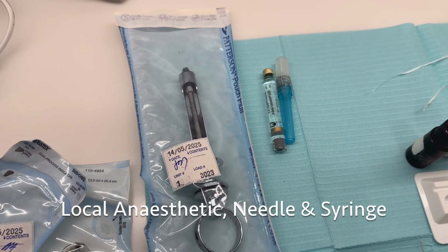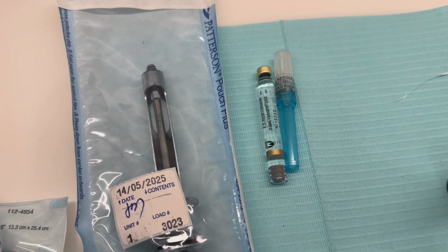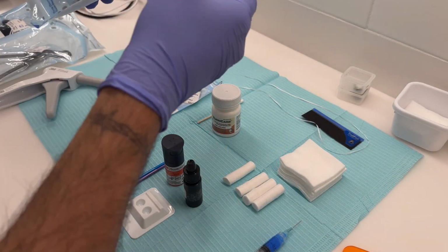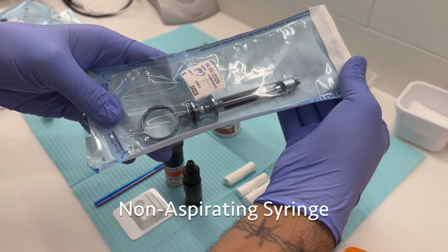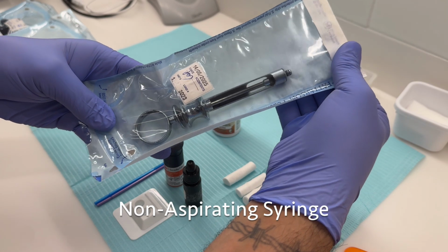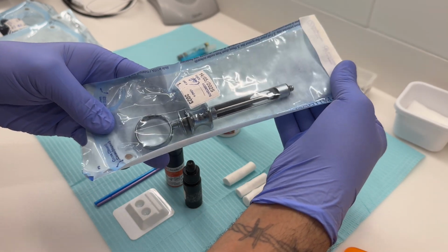Next, you're going to be grabbing your local anesthetic, your needle and syringe. Today, we are going to be using a non-aspirating syringe. That means that it doesn't have a harpoon end where the carpule goes. It's a flat end.